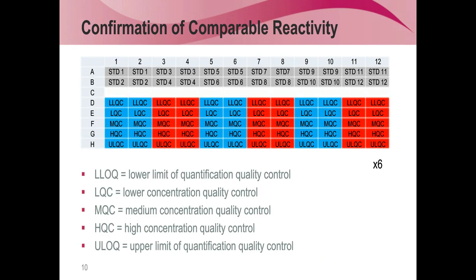Now, of course, we have made the decision that we move to a single assay and we have only one standard curve on the plate, which is ideally from the biosimilar. And then we put on 5 different levels, so LLOQ to ULOQ, that basically means different levels of QCs spread out over the whole analytical range, again from the biosimilar and innovator. And we also shuffle up in the 6 different runs we are doing the location of each of those sets. But they are coming from 6 different dilutions, which is usually not the case when you look at the normal validation.